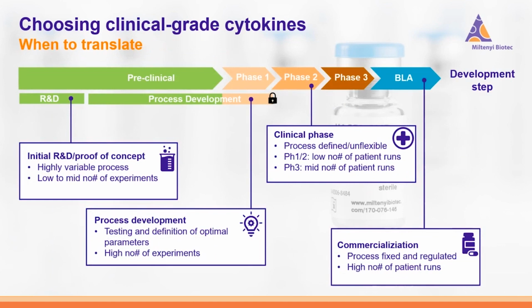So as a very, very last tip, there is another thing I would like to share with you, and that is when to translate to GMP cytokines. And I'm going to swim a little bit upriver, so against the current here, because what a lot of people will tell you is to switch as early as possible during process development, right? So that you work with what you use in your actual process, and that reduces the risk. And this is actually a great idea. But let me walk you through this, and maybe I can give you another perspective on that.